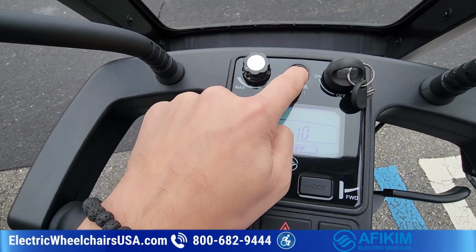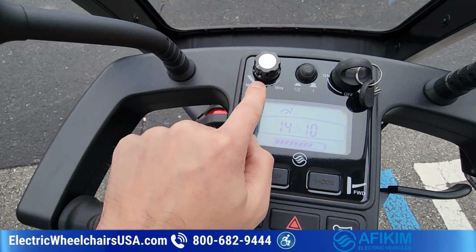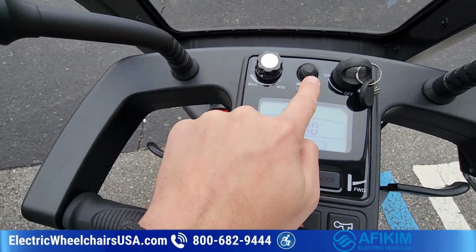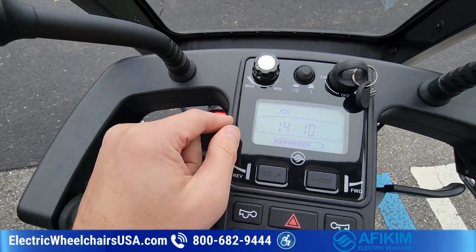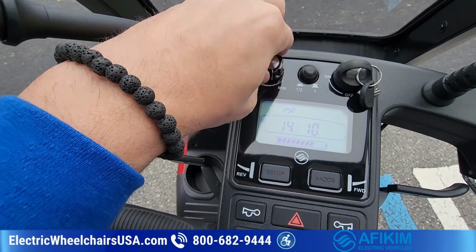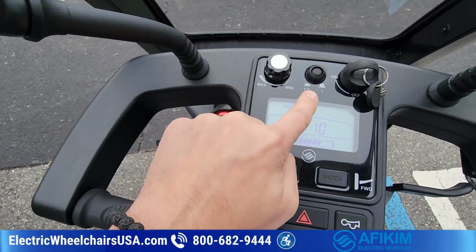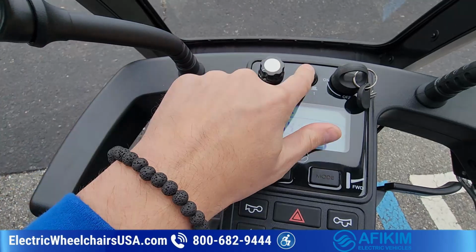If I have this button raised, it's in the 1 speed, and then this is turned all the way to the max. So when this is raised to the 1 position and this is turned all the way to the max, the top speed on this is 10 miles per hour. So you can adjust the speed on the 1 position and then adjust it using this dial, or you can put it in that half position and do the same thing and adjust it, I guess, more precisely.